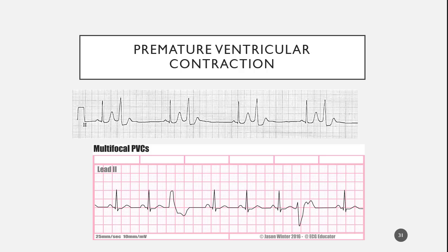When you see this rhythm, the correct identification of this would be normal sinus rhythm with, at this point in time, multiple unifocal PVCs. So I want you to tell me when there's more than one, is it unifocal or is it multifocal? Now, speaking of multifocal, let's come down here. What's the rate on this rhythm strip?